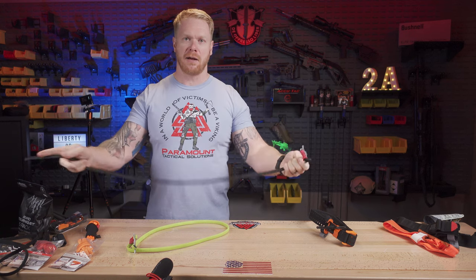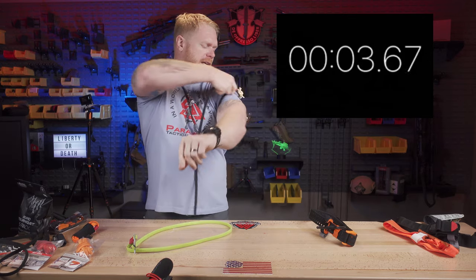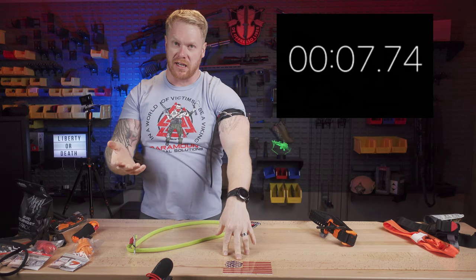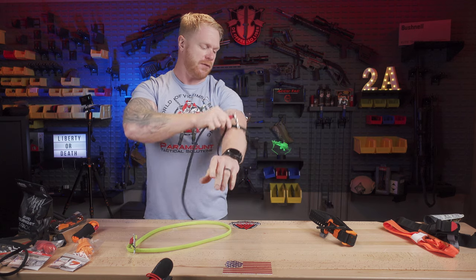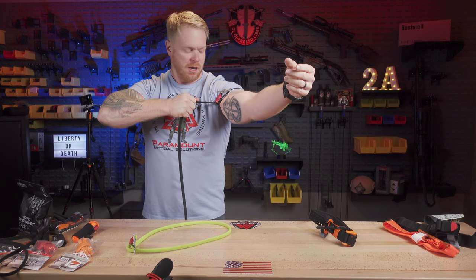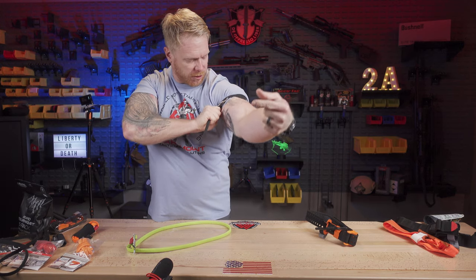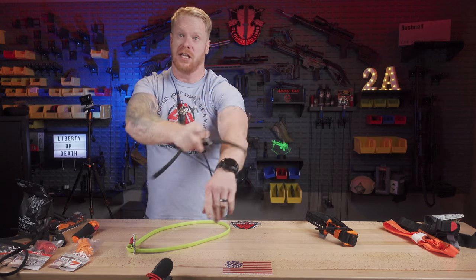So I've given you an overview of this tourniquet — now I'm going to use it in real time. Suddenly I'm injured — I throw it on my arm, get it as high and tight as possible, wrapping, wrapping. What's great about this tourniquet is within just a few seconds it's on. Even without a full tourniquet yet, just applying it and starting to pull is already starting to occlude blood flow. By one wrap, we probably have a full tourniquet; by the second wrap for sure. It's easy to use, simple to remember, and very fast.